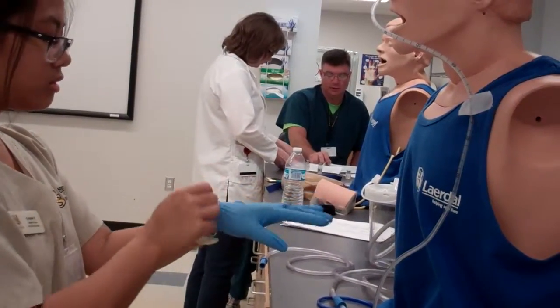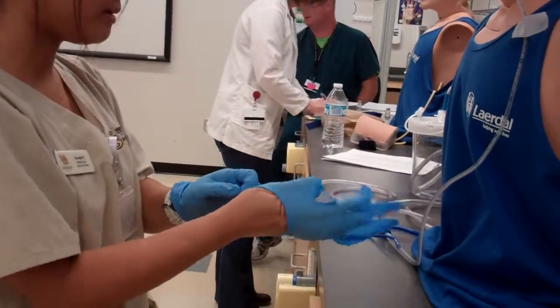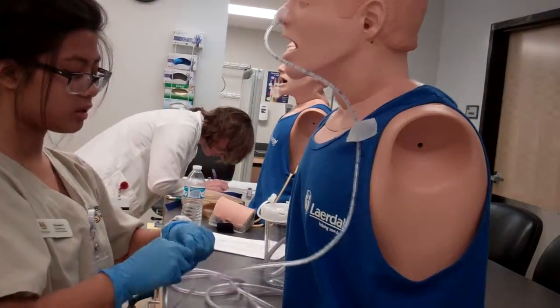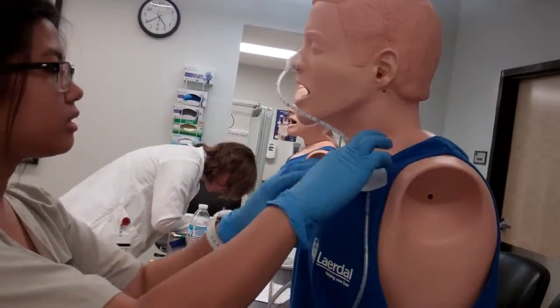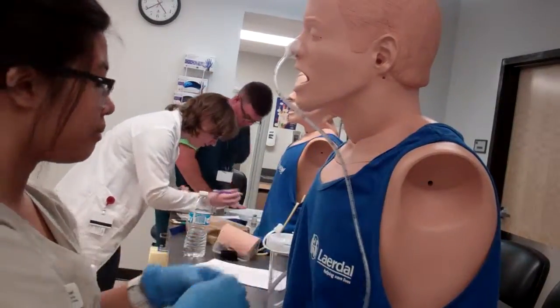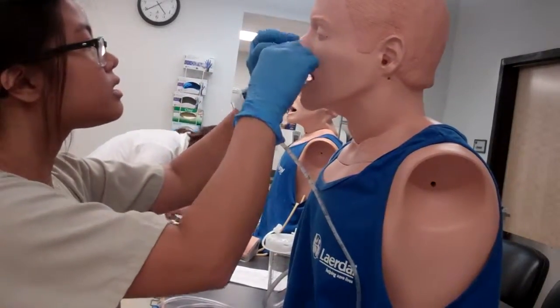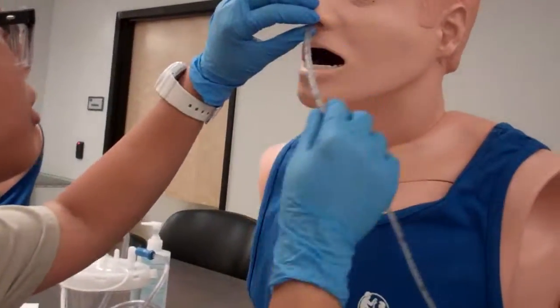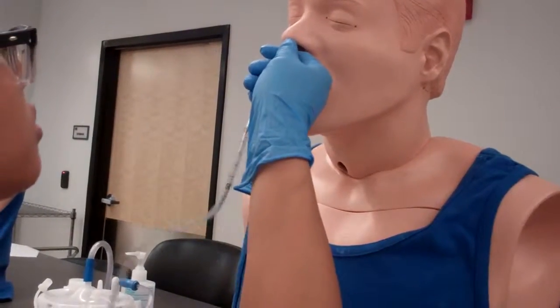How are you feeling? Good? Okay. So I'm going to go ahead and disconnect the tube from the suction. I'm going to clamp it so nothing comes out. I'm going to check the skin, and the skin is still intact. I'm going to place another bib on my patient, move the tape. And the tube is still in place at the 35 centimeter mark. So Mr. Schumer, I'm going to have you take a deep breath and hold it when I release it, okay? Okay. 3, 2, 1.